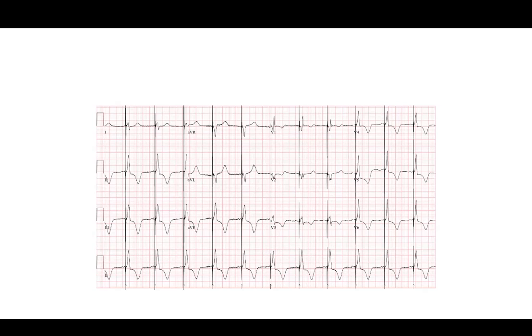I have to tell you, Francois, I do it in every patient. After I program, I do unipolar. And what does it look like in bipolar? I try all different AV intervals. And I think most of the time, it doesn't really change much. But when it does, it's quite clear, so I still do it on every patient just to see. But I would agree with you.